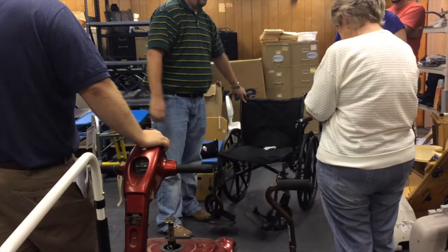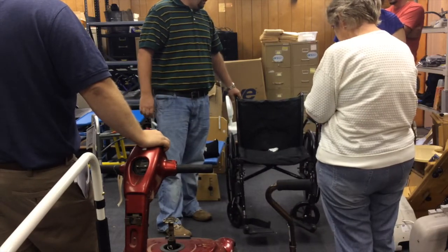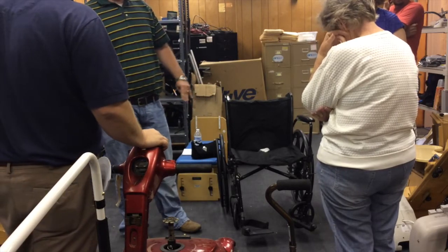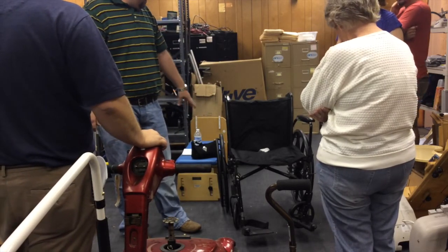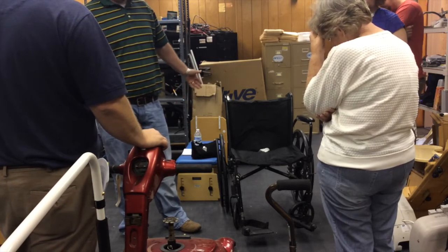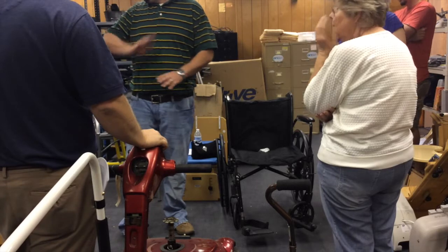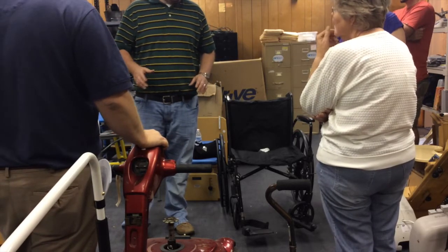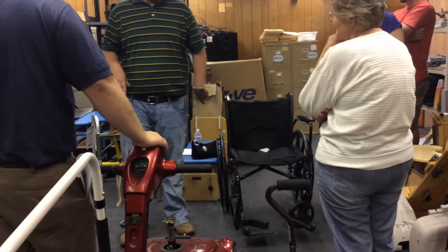Do you mean the big wheels or the middle wheels? I would take them both. I'm not saying do that with every chair, but these wheels are in really good shape so I would keep them. If you had a chair that's 20 years old and the wheels wore out, just throw that away. Use your judgment.